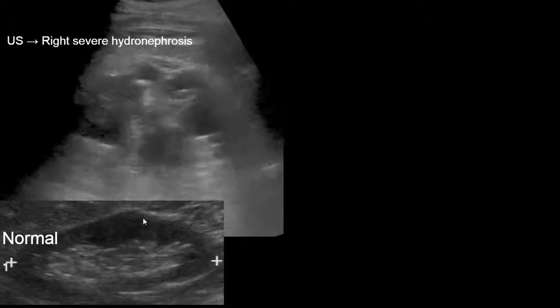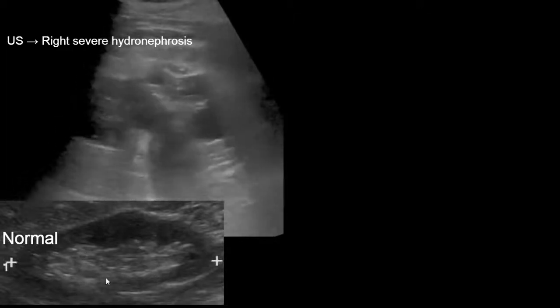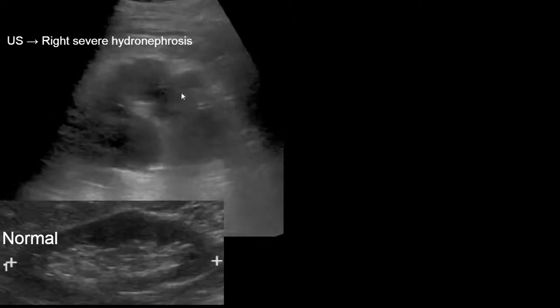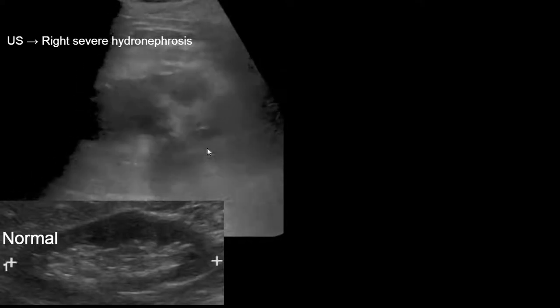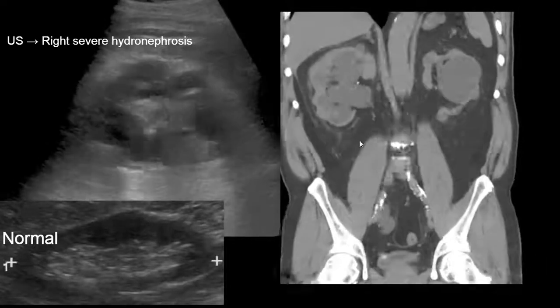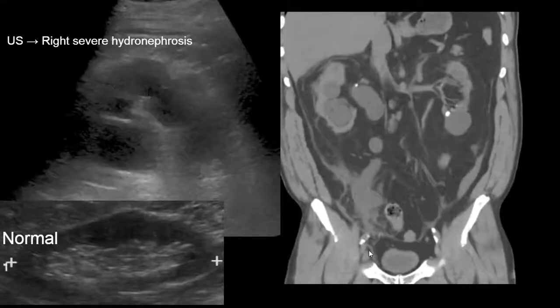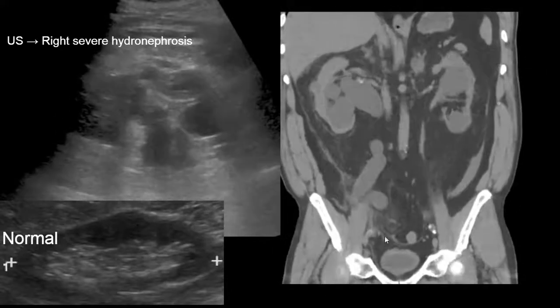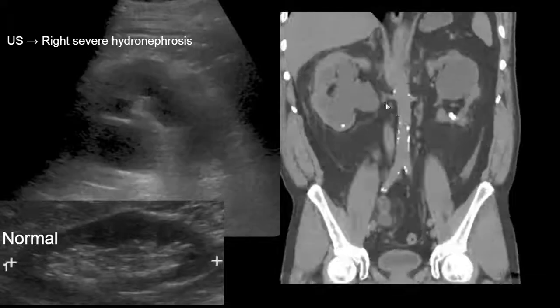Patients with stones can have complications, specifically hydronephrosis from obstruction, for example in the ureteral region. Here's an ultrasound demonstrating severe hydronephrosis. In comparison, a normal renal ultrasound shows the renal sinus fat. In contrast, the dilated collecting system in the central renal sinus fat area is consistent with severe hydronephrosis. CT shows a stone at the right ureterovesical junction causing upstream severe hydroureteral nephrosis.